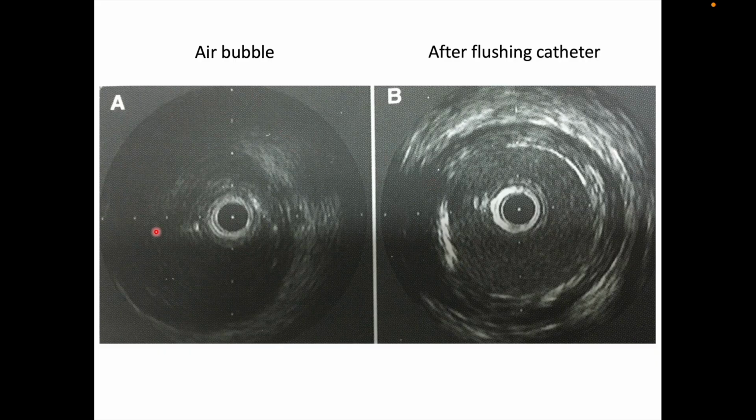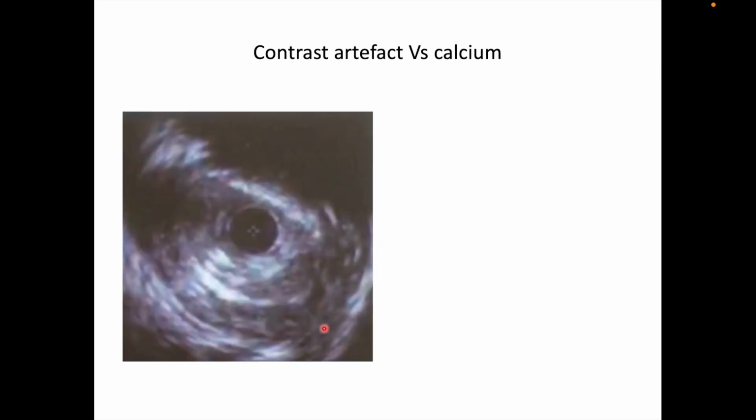You can see the whole imaging is lost. That's air bubble. And after flushing the catheter, you can see the same patient, same catheter, the visibility is back.